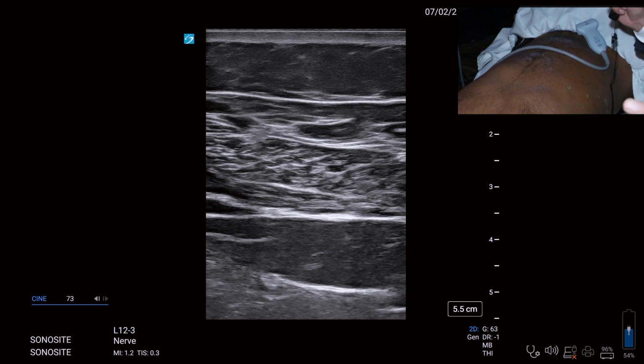Is it clear? So we have TAP here, we have transversalis fascia plane block here. And if I go more posteriorly, what muscle will you visualize? The quadratus lumborum. So the lateral quadratus lumborum and transversalis fascia plane block, my dear friends, are almost serving one and the same purpose. So I will try to show you once again where we are.